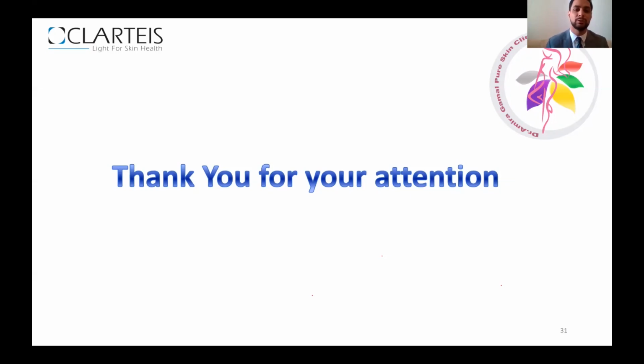To be clear, how many sessions did it take? I think it's maybe 10 sessions. Two times a week? Once per week. I started the first week twice per week. Then the next week I felt that it started to repigment, so I told her, because she's young, make it once per week.